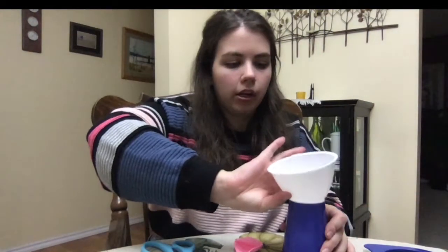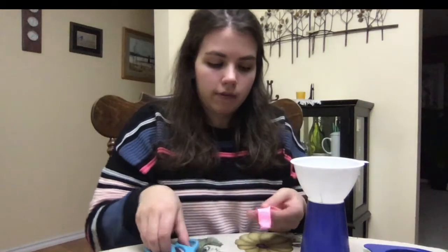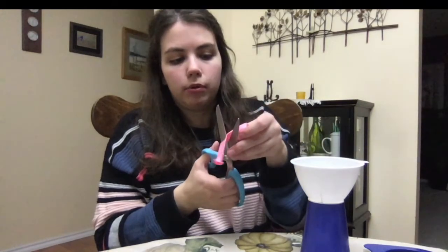I'm also just using a cup to stand my funnel in because it's going to be pretty tight to put that balloon over it. But let's get started. So first thing, we will just start with this. So I'm putting my funnel in my stand and I'm cutting my balloon.